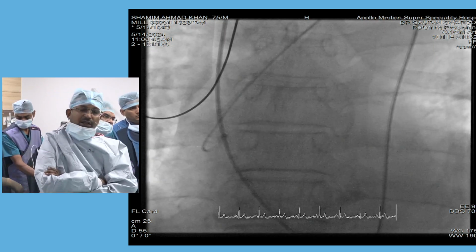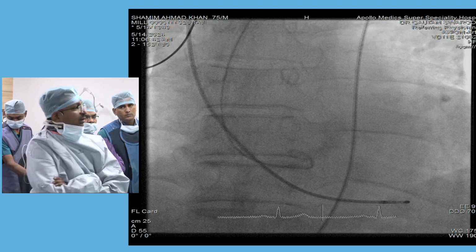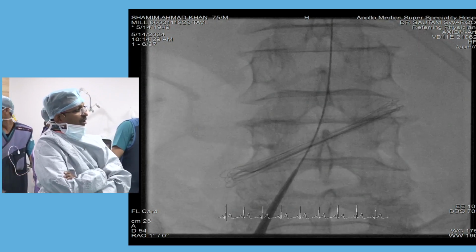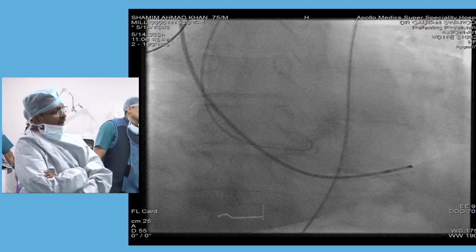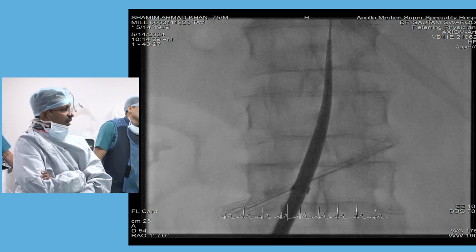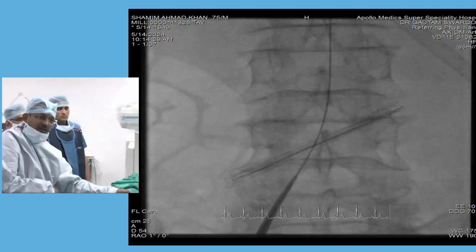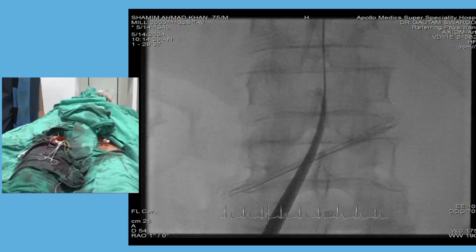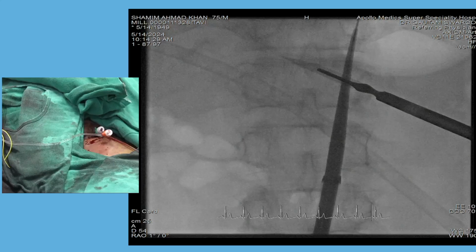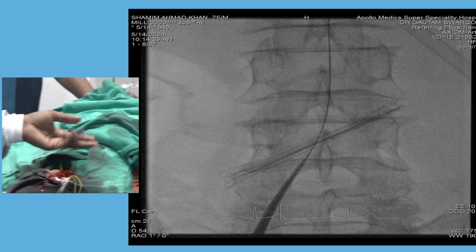So we took the right femoral access. Can you show me the sheath insertion? If you see this, we have taken the right femoral access and we put the 18F sheath via the right femoral access. We put the pacemaker from the jugular access, and prophylactically we have taken two accesses on the left femoral artery. One is for the snare. We were of the appreciation that if the valve will not cross, we will do it by the snare only. So again this was our backup plan.